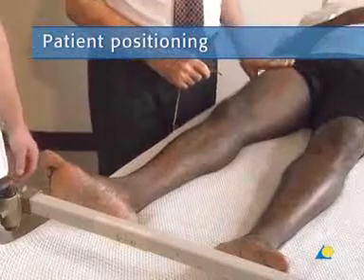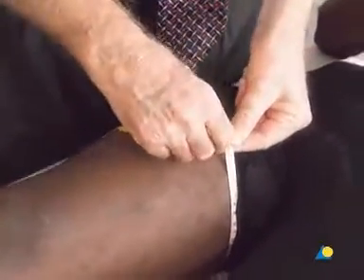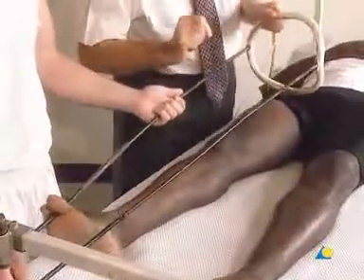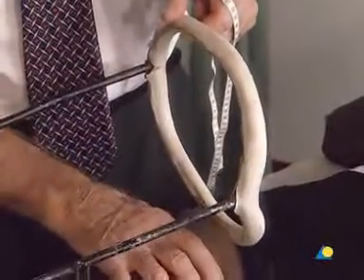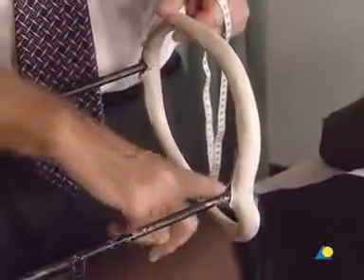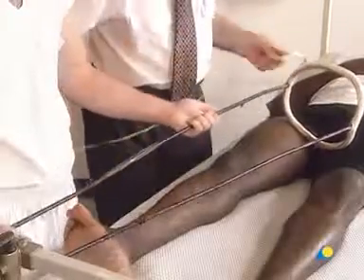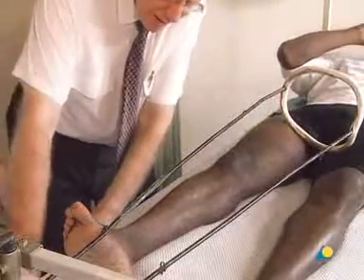The patient should lie on his or her back. To begin, the circumference of the thigh is measured to establish the size of the inner circumference of the Thomas splint. Here the circumference of the thigh is sixty centimeters. When choosing the Thomas splint to be used, four centimeters should be added to the measurement to allow for swelling, so a splint with an inner circumference of sixty-four centimeters is selected. The length of the patient's leg is measured, and twenty centimeters are added to establish the length of the Thomas splint.